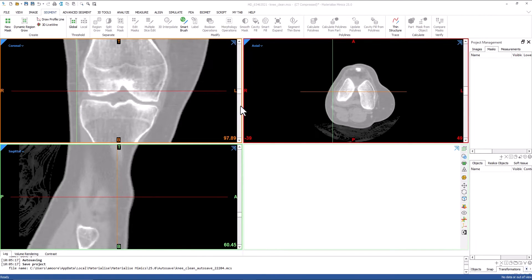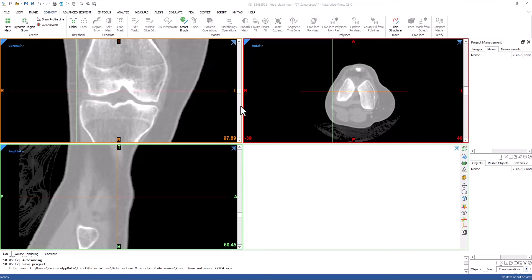For this example, we will be looking at a simple segmentation of the knee. The final output will be individual parts for the femur, tibia, fibula, and patella. This is a basic example, but the CT Bone Wizard will also work on more complex cases.